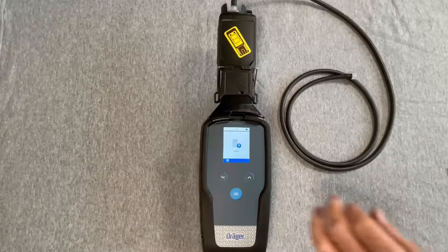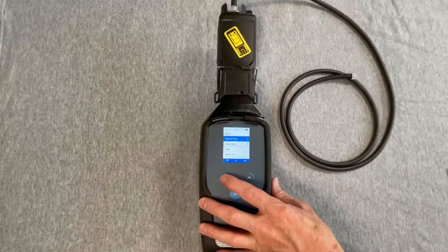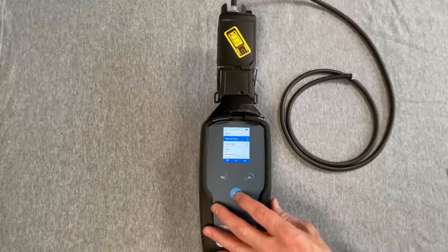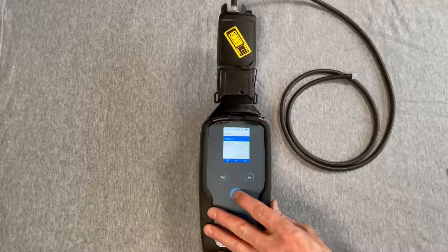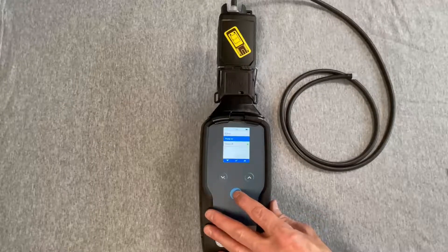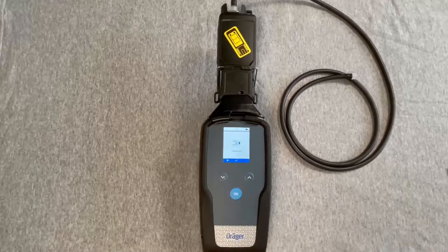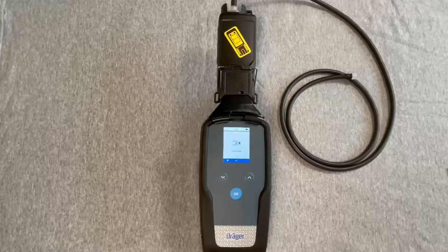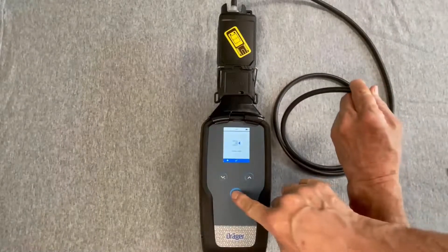Press the button below the menu symbol and the remote pump is highlighted. Press OK below the check mark, and pump on is highlighted. Press OK again to activate the pump. The prompt to close the inlet is on the display, so block the inlet of the hose and press the OK button.